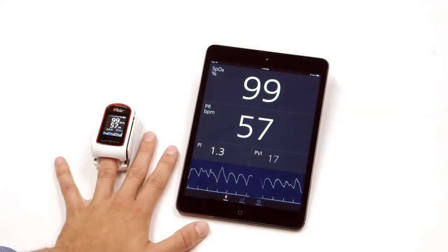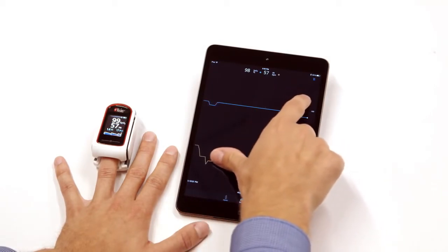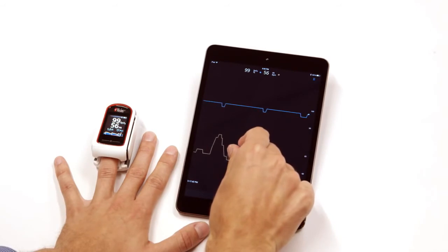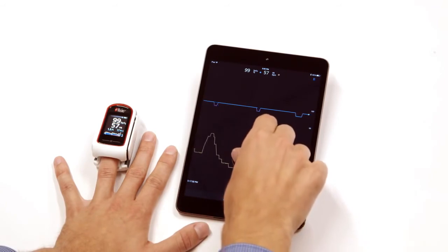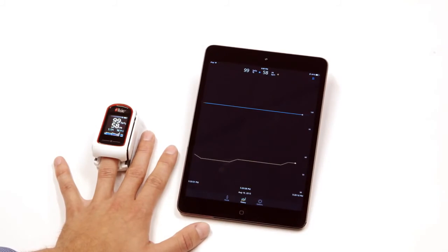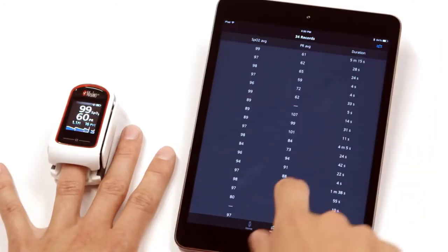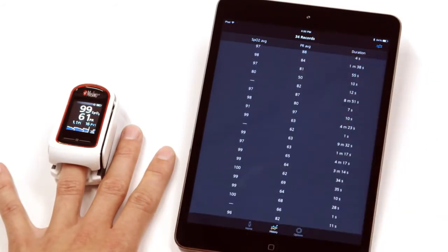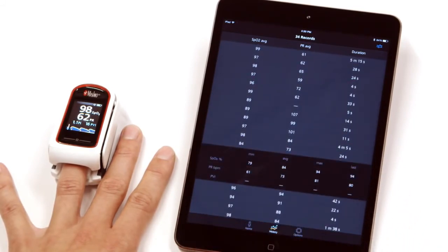Tap on the History icon to see your parameter trends. The MightySatRx will record up to 12 hours of parameter data. Toggle on the trend lines and use two fingers to expand or shrink the time scale you wish to view. To see the measured parameter values, tap on the blue trend icon on the app. Scroll down to see additional recorded measurements.